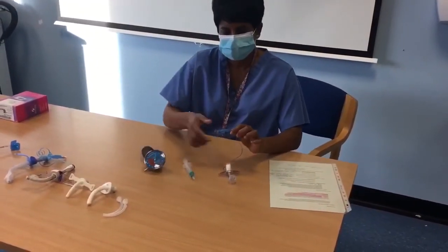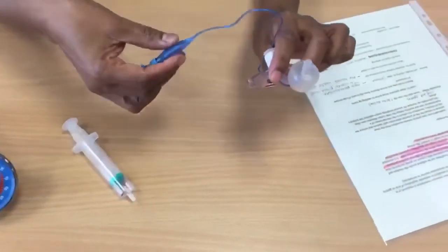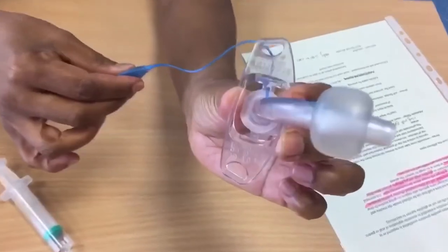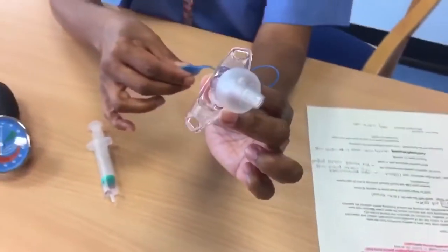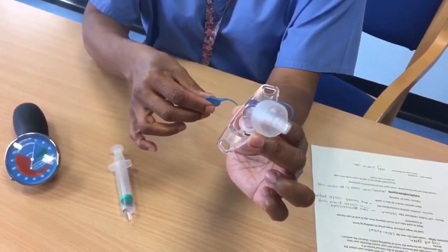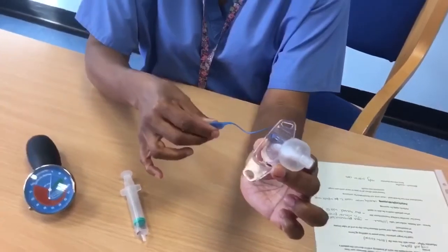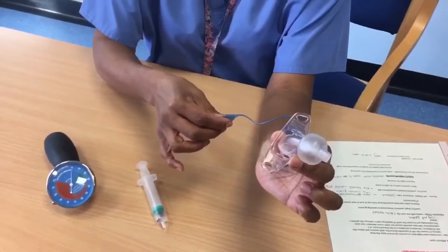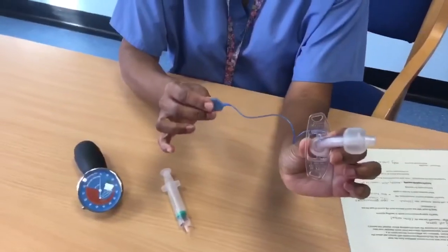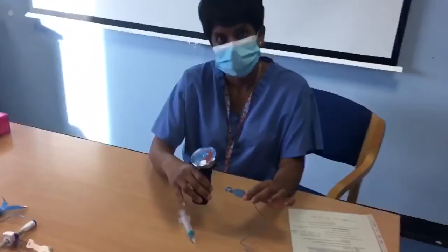The temptation is to give our pilot balloon a little squeeze, but if we were to do that, you might notice what's happening in the patient's trachea. If I squeeze that, the cuff is causing undue pressure to the tracheal tissues. So if we were all doing that, you can imagine the damage to the trachea. So to avoid squeezing the pilot balloon, always use our manometer.